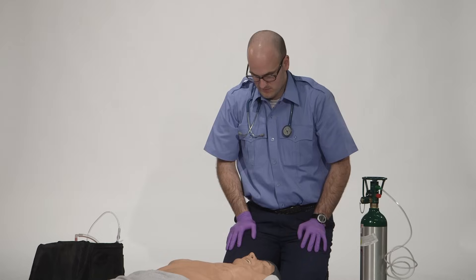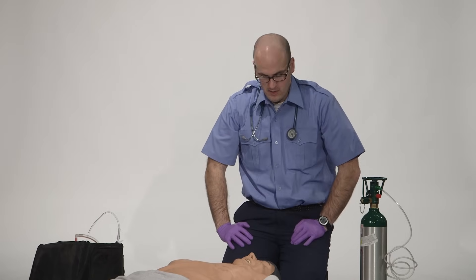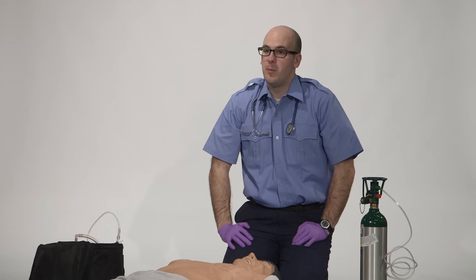Welcome to emtprep.com. This is the bag valve mask ventilation of an apneic patient skill. Before we get started, I would like to discuss some of the key points to ensure your success.